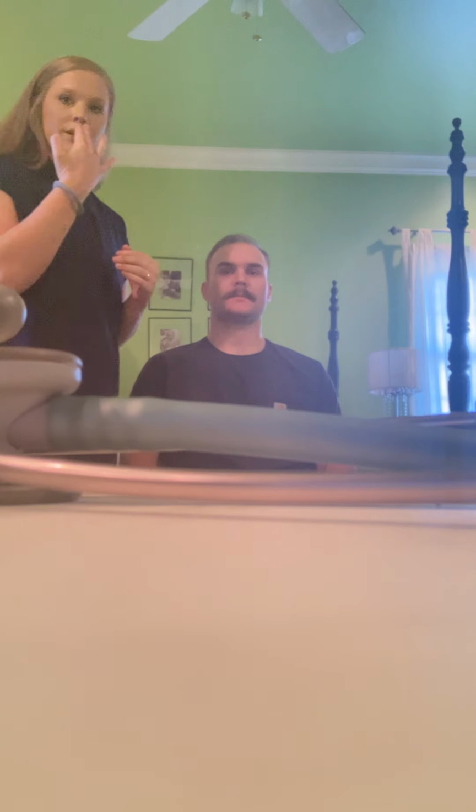Also at this time I would use the otoscope to look up into the nose, and we would look for just patent airways, looking for any polyps or masses, anything blocking the airway. But if you'll just go ahead and look up for me, I'm going to look with my light, and we see that the airway is patent. There are no polyps, and there's no septal deviation.